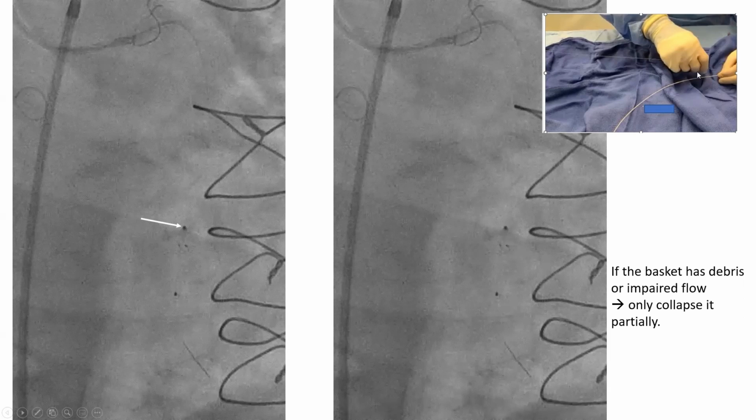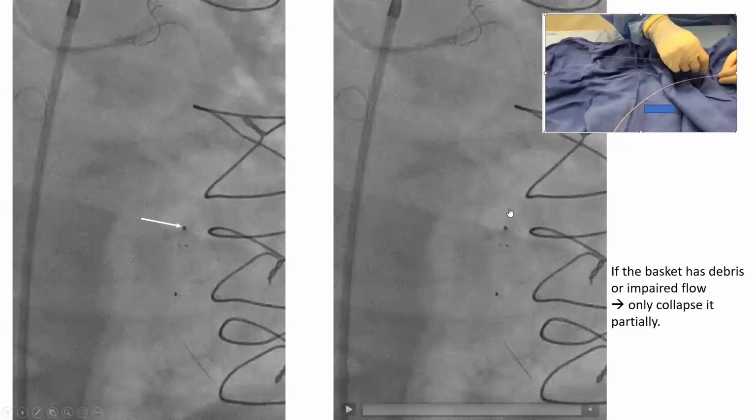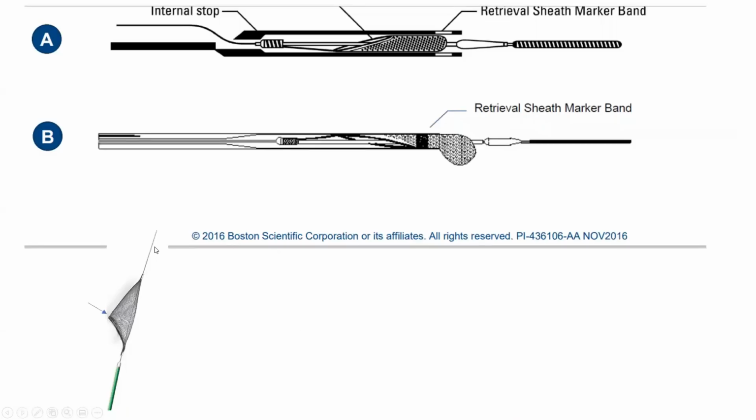You may need to pull more with this hand grabbing the filter if the filter dives in. So you adjust your push and pull accordingly to keep the filter in place. Usually more push with this hand than pull. Now, if the basket has debris or impaired flow, only collapse it partially. Normally you can collapse it fully, pull it all the way till even the distal marker is inside the catheter. But when there is impaired flow or when you see visible debris, then you don't need to fully collapse it. Collapse it only until here. So you partially collapse it, past that arrow that I show, okay? Because you don't want to spill over those debris. This is what we call full versus partial collapse.